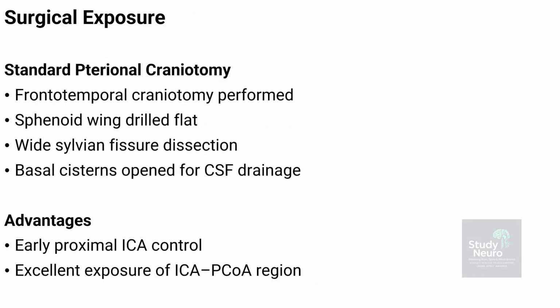Surgical exposure in posterior communicating artery aneurysm surgery begins with a standard pterional craniotomy, which provides a direct route to the anterior circulation and the carotid aneurysm complex. It is the main entry point.